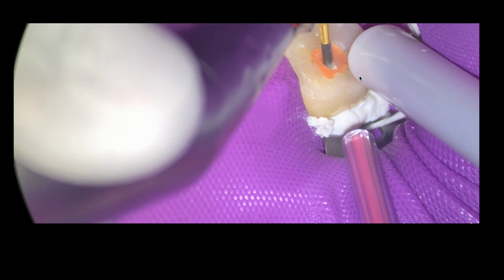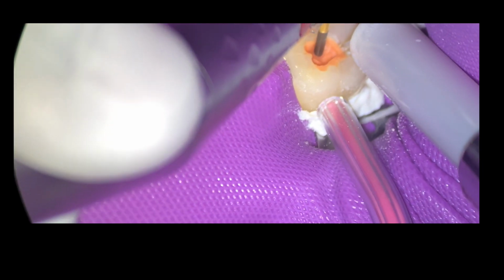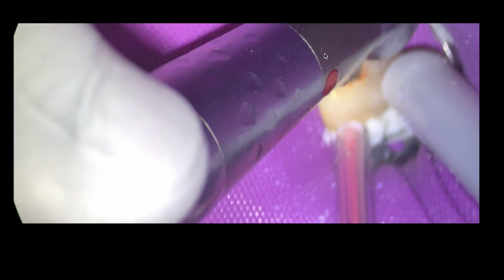You can see it's a great material. This has been in there for 4 months, and it's not even worn away. So I find this stuff really hard to cut through with a round burr. So what I did was take whatever I could find. It was actually a transmetal burr, which is great if you're cutting through metal like gold, not so much amalgams, but especially gold crowns, and you don't want to chatter. This is a great burr because the way the flutes and the fissures are designed, it cuts through metal, and it just makes this like butter.